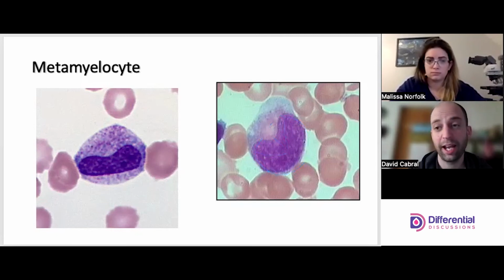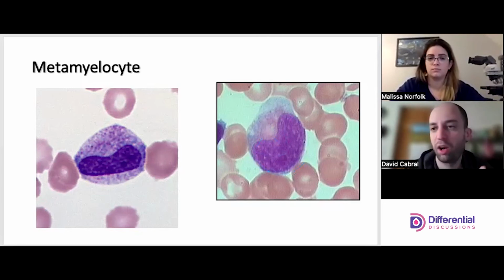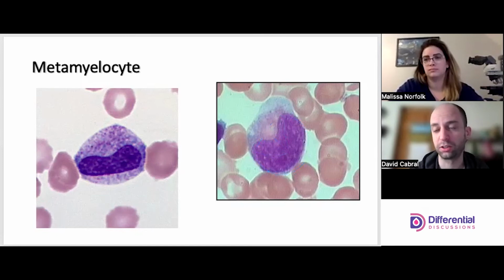I do think there might be some people yelling at the screen calling the left-hand cell a band. This is an incredibly divisive topic in laboratories. It is extremely difficult to competently train staff to make these calls together. So there might be some people dissenting.